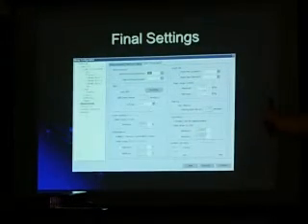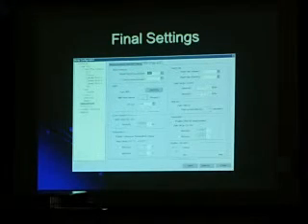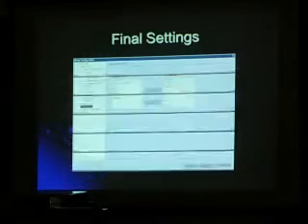And some of the systems actually have built-in vital sign recording capabilities, so you'll be able to program all that type of information: when the alarms are going to go off for low O2 saturations, how often the blood pressure is going to do different things, that sort of stuff.